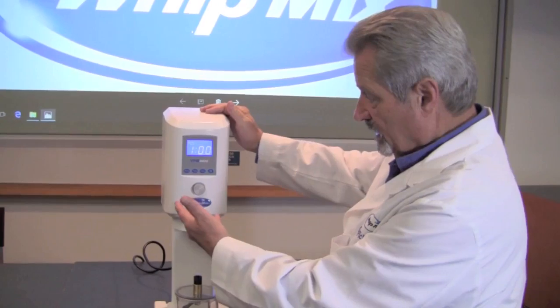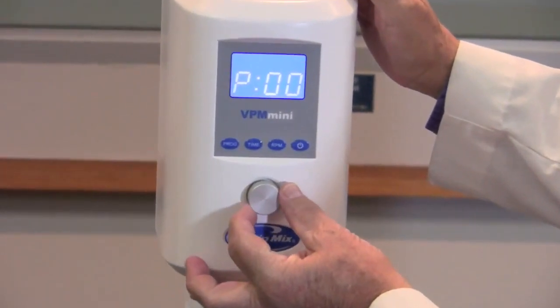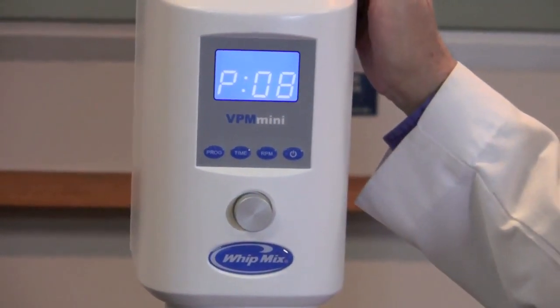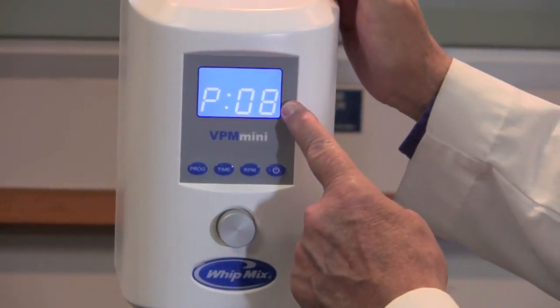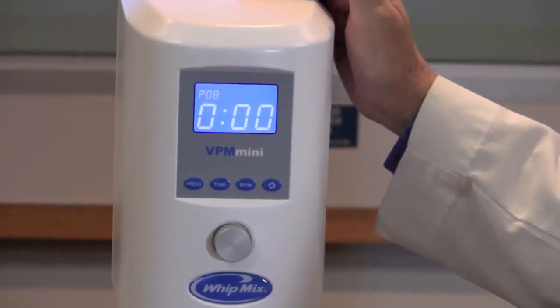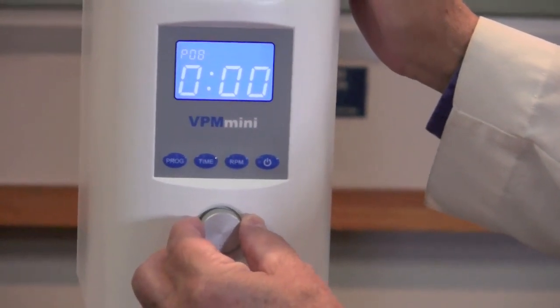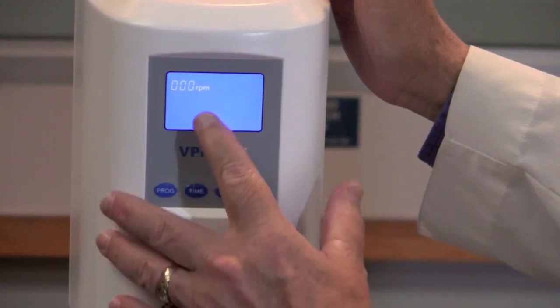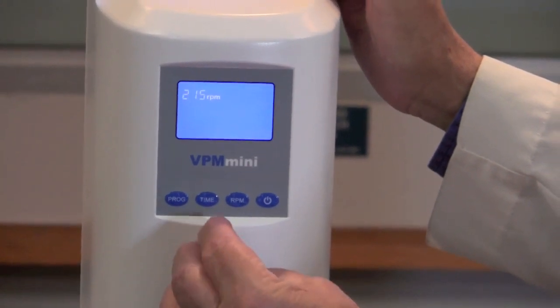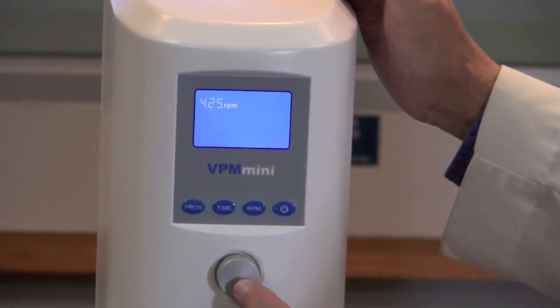Now we're going to program the machine. Go over to the left-hand side and select the program button, then use the silver knob in the middle and turn it either left or right to select a program that you would like to program information into. Once you've selected the program number, simply press the silver button. Now you've selected the program and it's going to ask you what RPM you would like. Go ahead and press the RPM button — you'll see the RPM notation in the top left. Turn the silver knob until you reach the correct RPM for your particular product, then press the silver button.